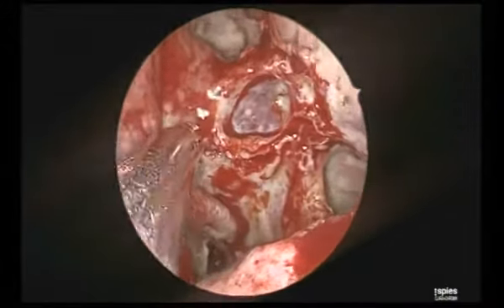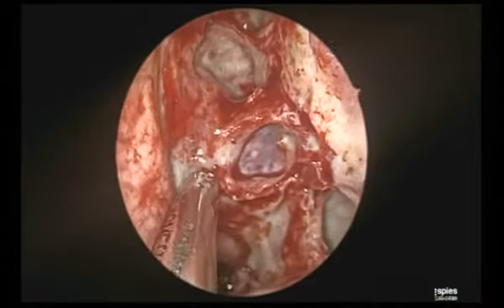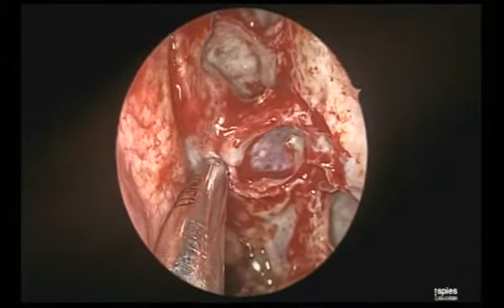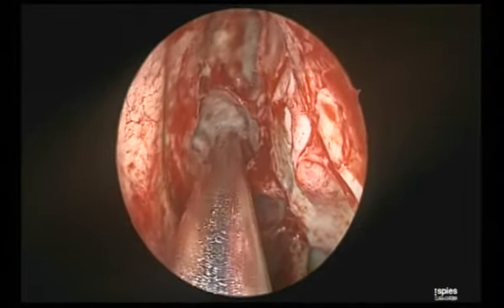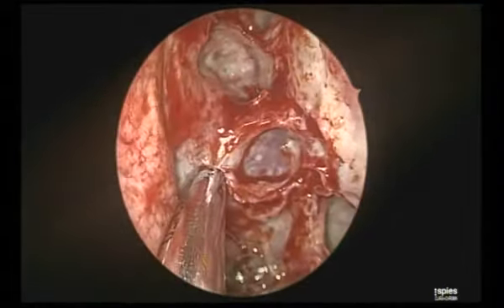See the upper border of the maxillary sinus? Very nice. Medially into the ground lamella, where the first part of the turbinate turns into the second part. Before you go there, where should you not do it? Commonly, where do people go? If I go there little above, you know where I can go? Skull base. So you have to stay inferiorly.